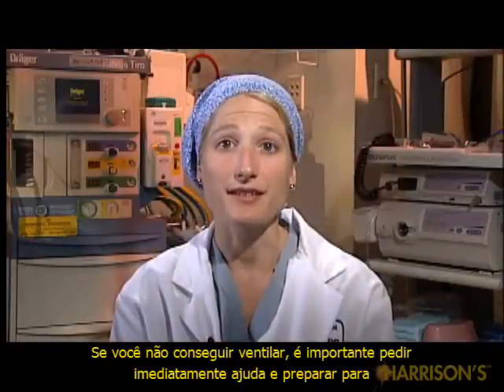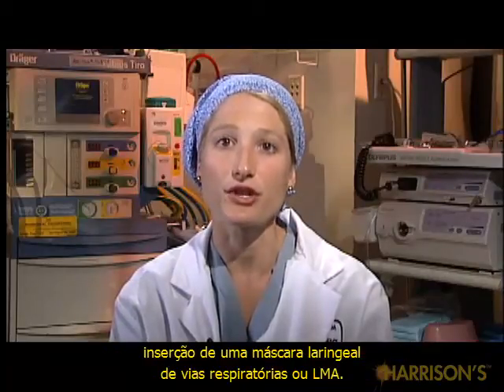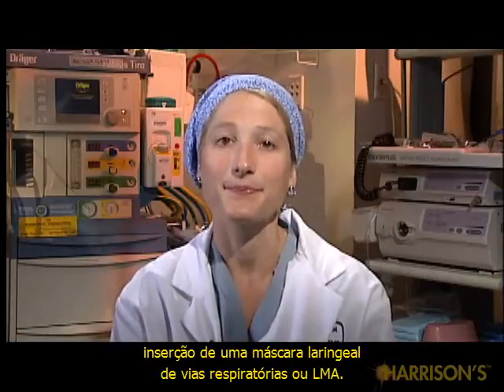If you are unable to ventilate, it is important to immediately call for help and to prepare for insertion of a laryngeal mask airway, or LMA.